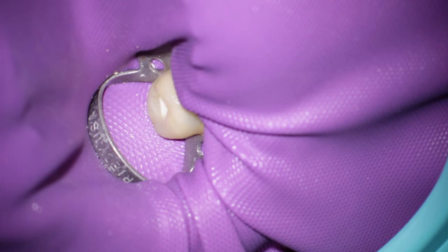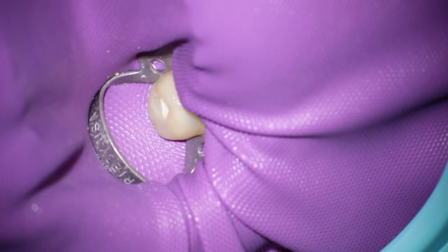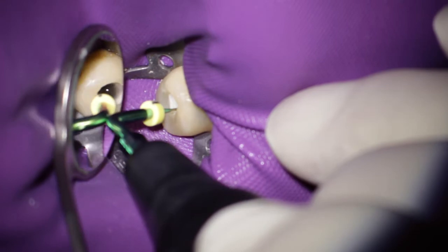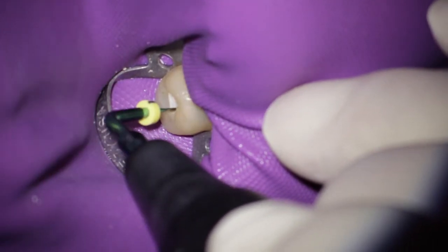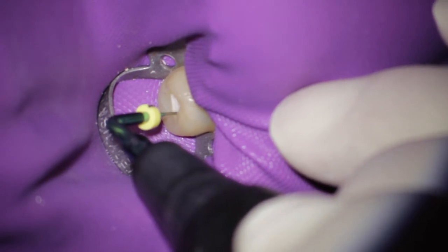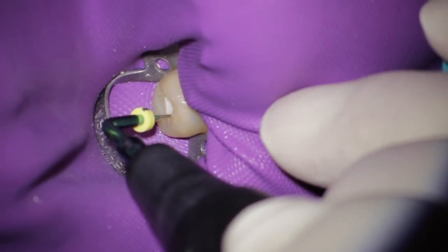The next one is an example where you can see again the power of ultrasonics. It would have been a great advantage if I had a high-speed camera to show this in more detail. An ultrasonic tip is inserted in a canal which is flooded with sodium hypochlorite. Now watch the development of nodes and antinodes along the file.